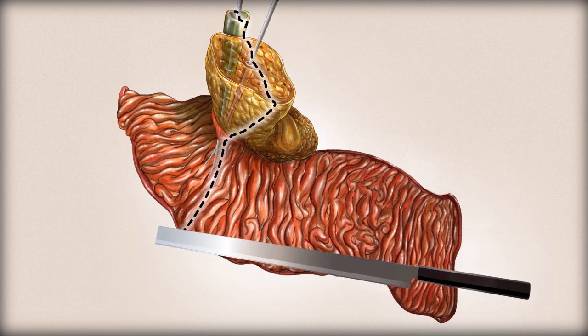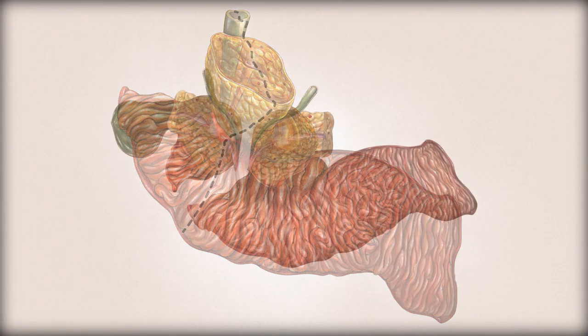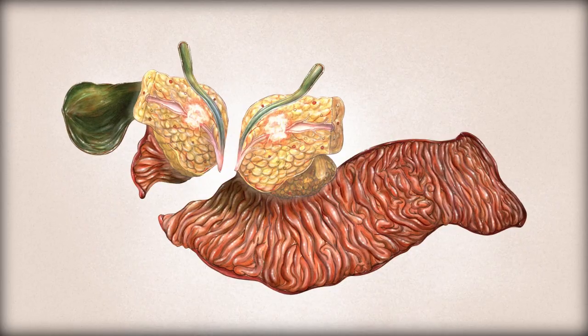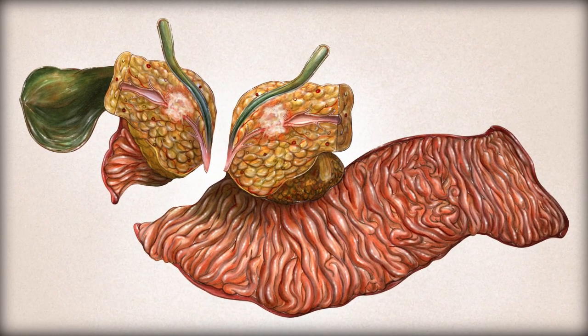It is best for one person to hold the probes while another makes the cut so that the blade never loses contact with the probes. If the cut is made successfully, the two ducts will have been bisected, the pancreas will have been filleted open, and the duodenum will have been cut in half.